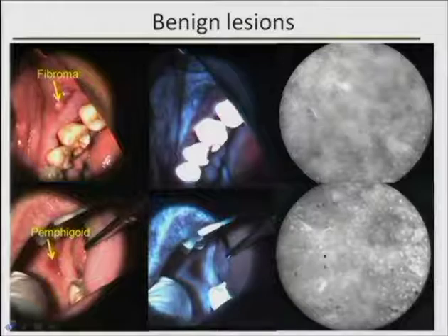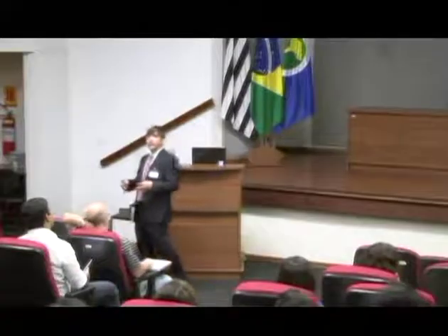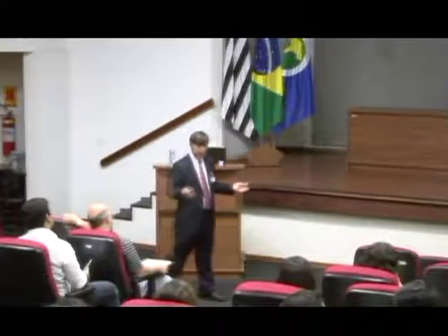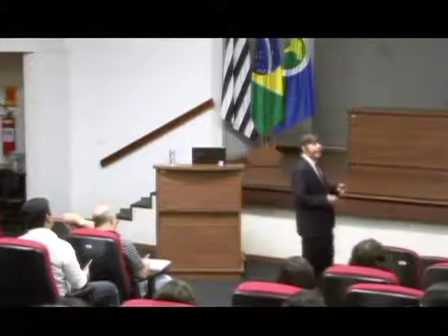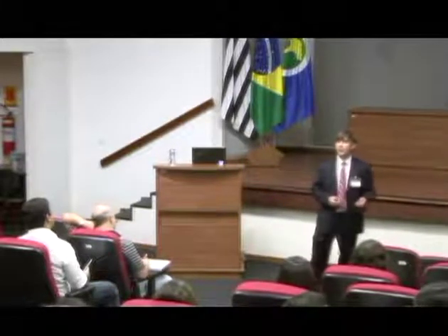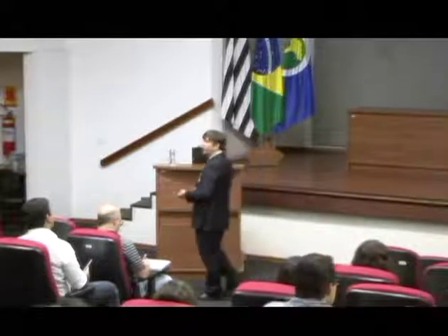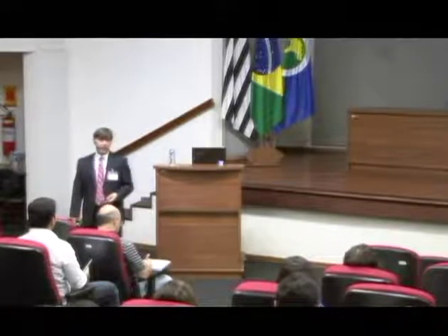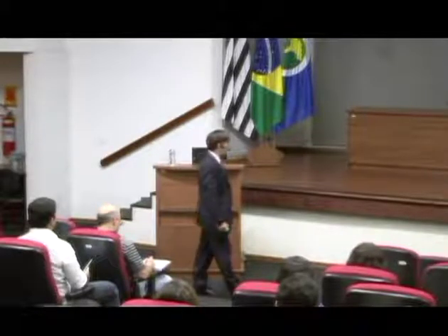Now, another situation where you might consider using optical techniques is in not just surveillance of high-risk patients, but say, well, can we extend this to some sort of more general screening? That gets a little more difficult because if you're screening a general population, first you have to have a really high specificity in order to be effective. And second, if you're looking at a more general population, there is a wide variety of benign lesions that affect, for example, the oral cavity that can cause all sorts of problems with your optical diagnostics.